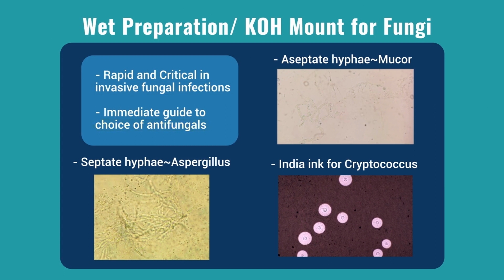In the cerebrospinal fluid, we do a negative stain known as the India ink or the nigrosin stain to look for capsulated yeast-like organisms, that is usually Cryptococcus. So this is a common cause of meningitis in HIV hosts with advanced AIDS syndromes.